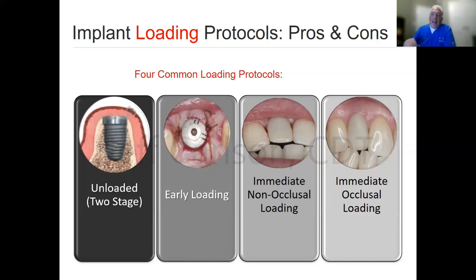With some patients, you want to do progressive bone loading, sometimes in that softer bone, especially in the maxillary, even sometimes in the premaxilla. Progressive bone loading means that the crown itself, which would put the crown, the abutment, and the implant, because it's all connected, into function, a direct, immediate function from loading. Whereas as you see here with non-occlusal loading, you keep it out of occlusion, with the theory that it's not going to have that much occlusal loading for either direct loading, axial loaded, or off-axis loading. But then again, diet is going to be very important.